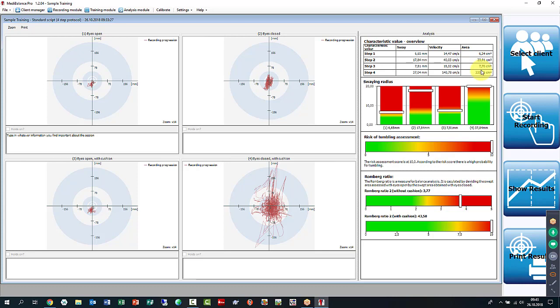So it's like a huge step. Perfect standing in the first 3, and then a really high difference, like 10 times the original value in the final measurement. So it doesn't have to be above 100, but if it is above 100, that's an indication for something very unusual. And then we need to see why this is.